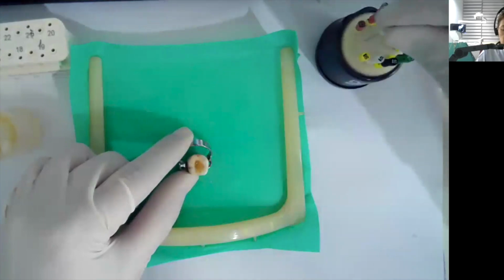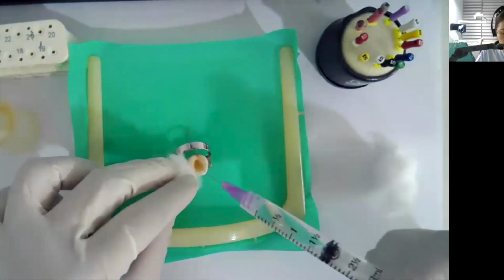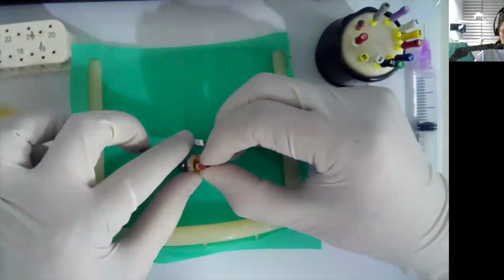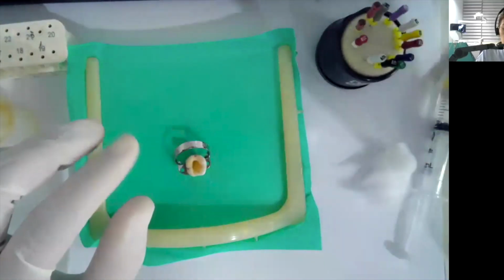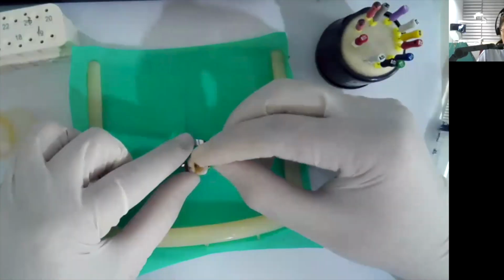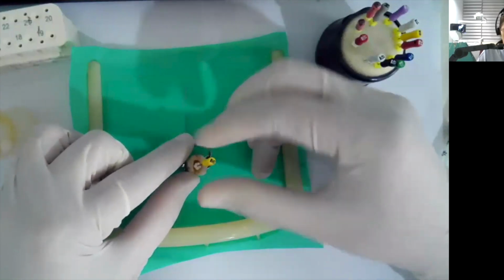And then, of course, I have to irrigate again. Okay, I will irrigate. I'll go back to the patency file. Okay, it reaches the reference point. So after using the 55, I'm now going to use the size 50. Up to what length? That should be 11 mm. So I'm enlarging now the cervical third.